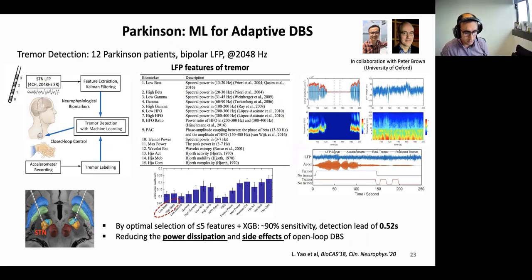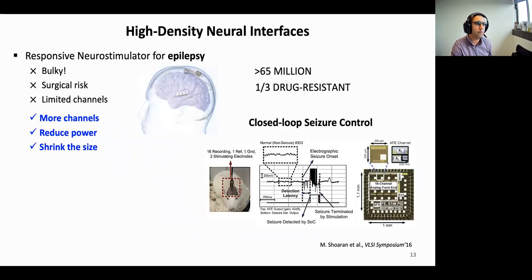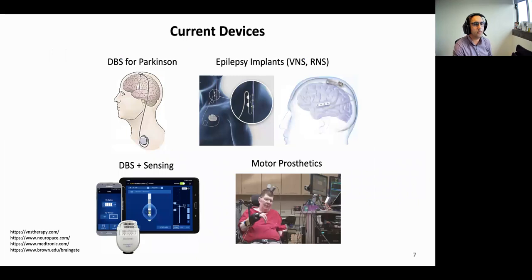And going back to what Greg Watkins asked, the patient acceptance of surgery, for example, in epilepsy, or these techniques or the implant, let's say NeuroPace or other things, plays a major role. So what was your experience working with patients or working with these technologies in terms of how is the patient acceptance for any invasive techniques or heavily invasive techniques with respect to the benefits they get?